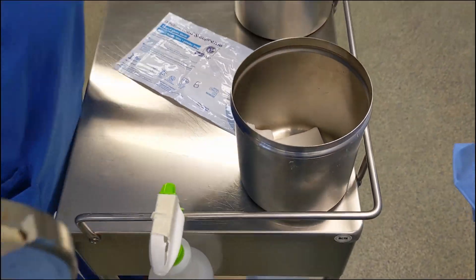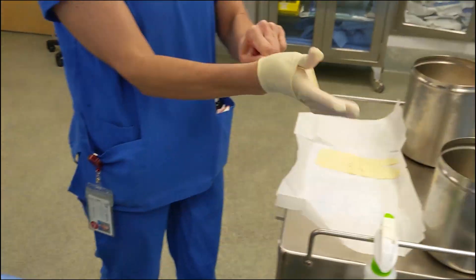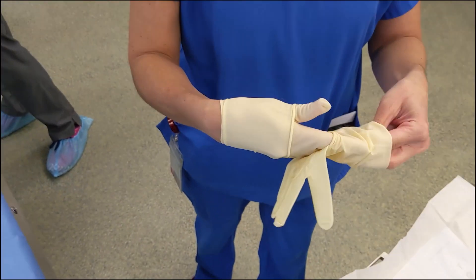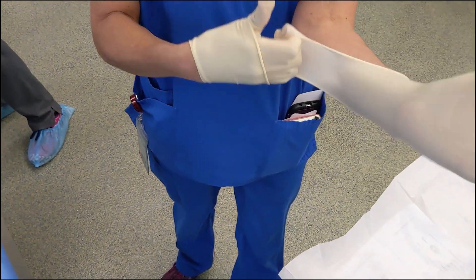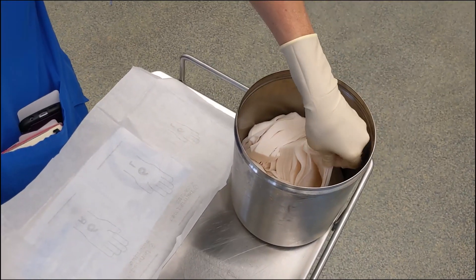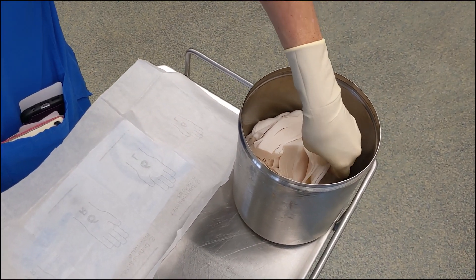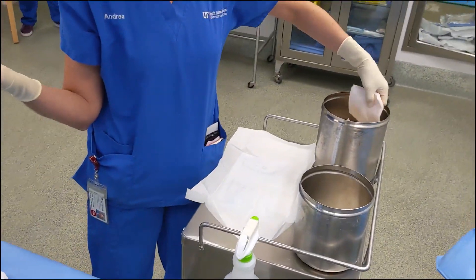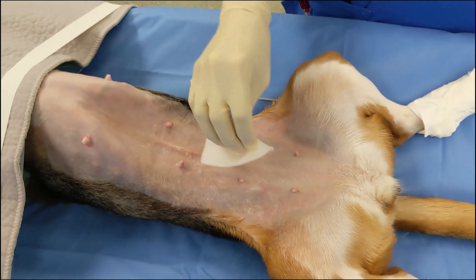To keep the container sterile, you should only ever reach in with your non-dominant hand. Sterile gloves are worn using an open glove technique, with care taken not to contaminate the outside of the gloves. Your non-dominant hand is designated as the clean hand, which can repeatedly reach into these sterile containers, and your dominant hand is designated as the scrub hand, which does all the dirty work. A fresh gauze is taken from your clean hand each time.